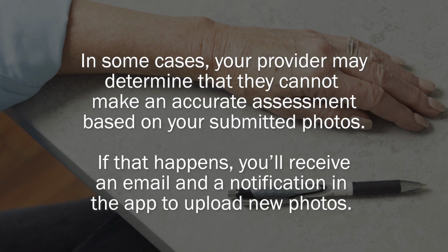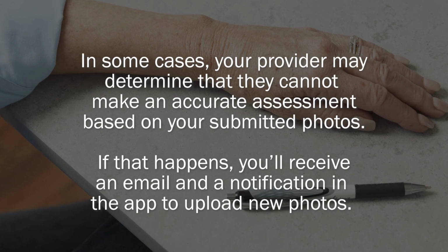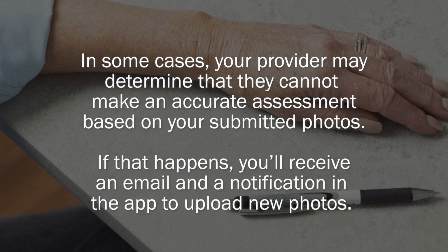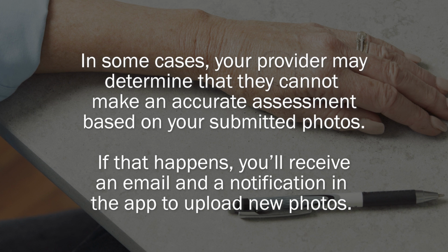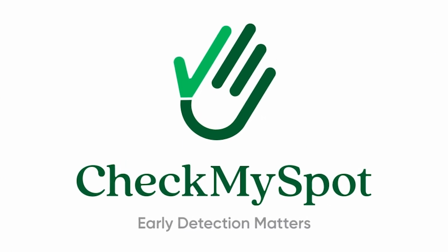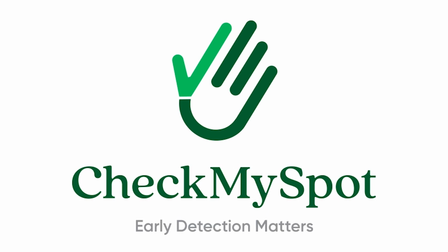In some cases, your provider may determine that they cannot make an accurate assessment based on your submitted photos. If that happens, you'll receive an email and a notification in the app to upload new photos. We're still on the case. Just need to make sure that your lesion is captured as clearly as possible.